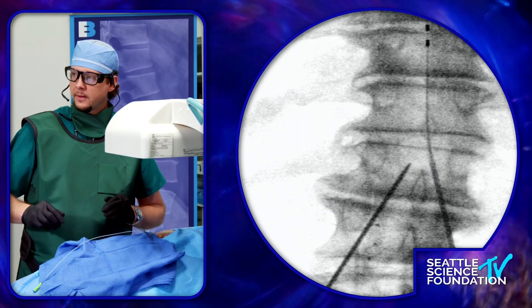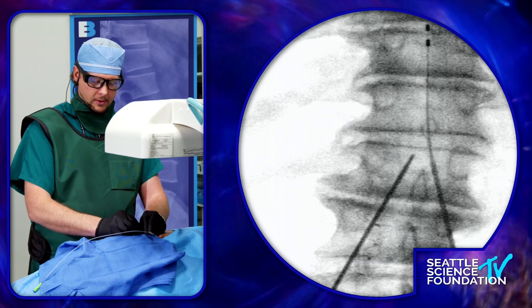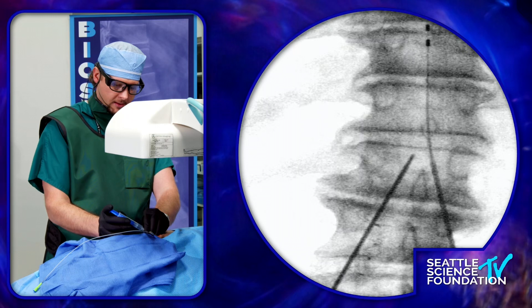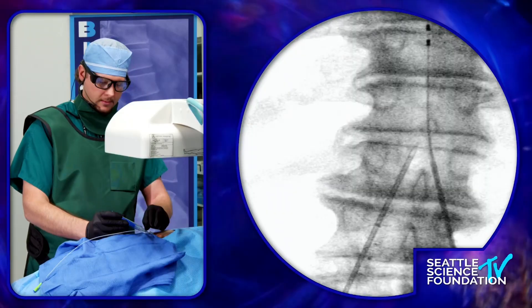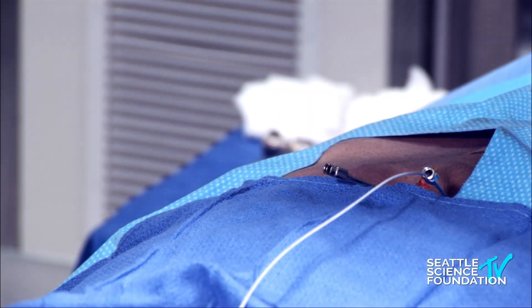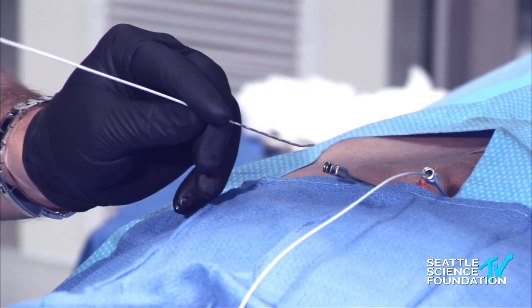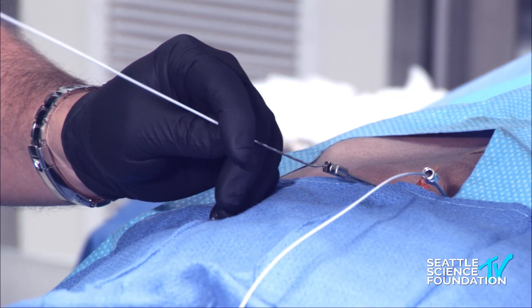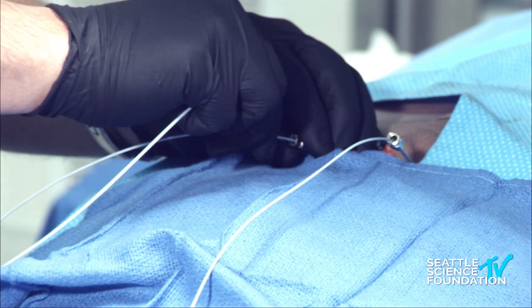Stepping off there, accessing — you can use a loss of resistance technique or a mechanical kind of loss technique. I'll go ahead and use a little bit of air, but the space has already been compromised. So it's just tactile feel as well as loss of resistance. Just one more shot to see where we're at, coming up midline toward the dorsal space. I have the lead and I like to come in with the curve pointing up, so that as it goes in it's going to glide dorsally and not as much to a lateral or medial trajectory.